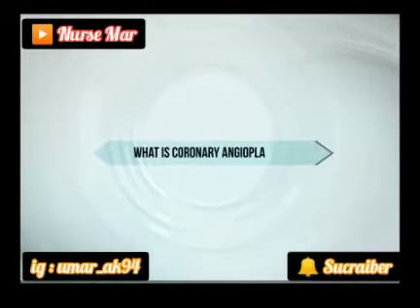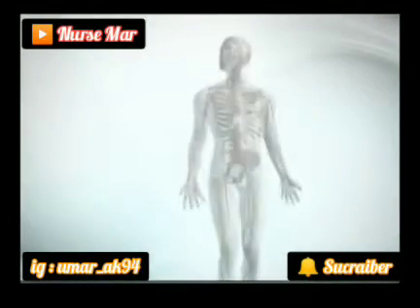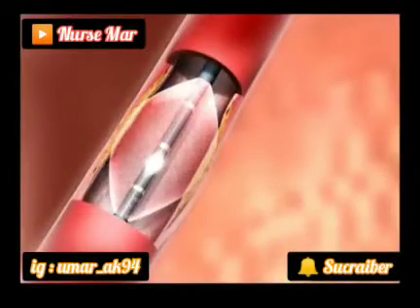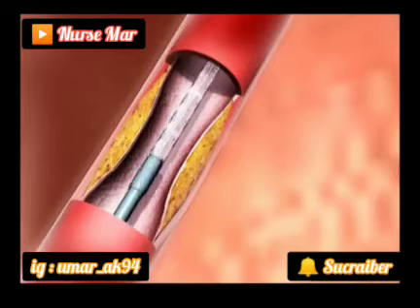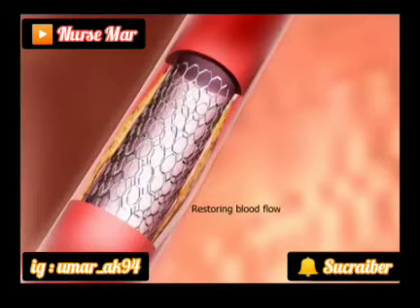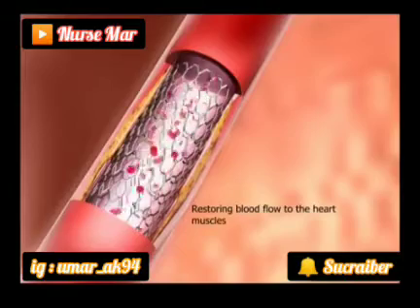What is coronary angioplasty? Coronary angioplasty is a medical procedure which opens up blocked blood vessels, thereby restoring blood flow to the heart's muscles.